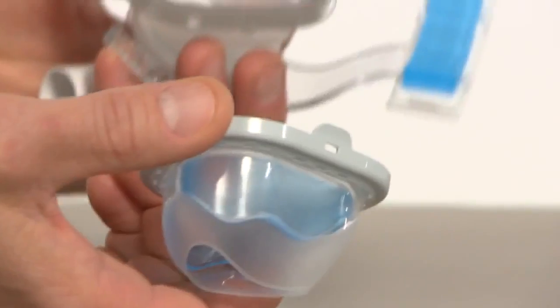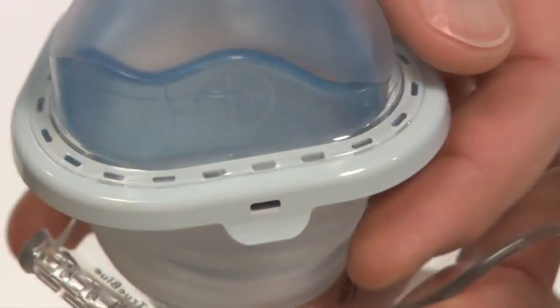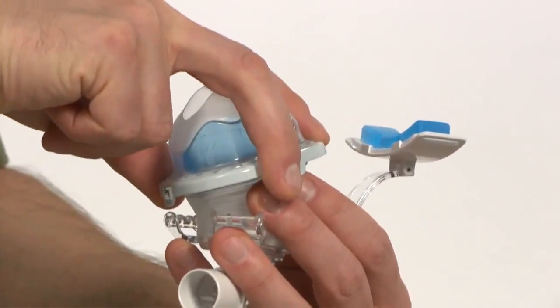Place the cushion and flap with the tabs facing downward over the spring frame. Press gently on the sides of the flap until all three sides click into the spring frame. Gently tug on the cushion to make sure that it is securely in place.